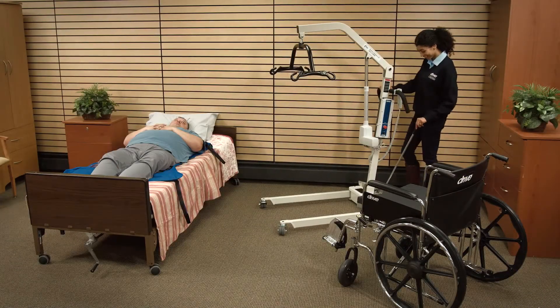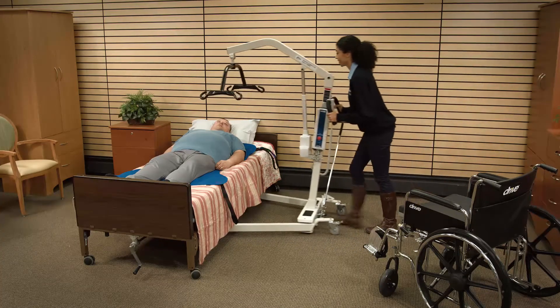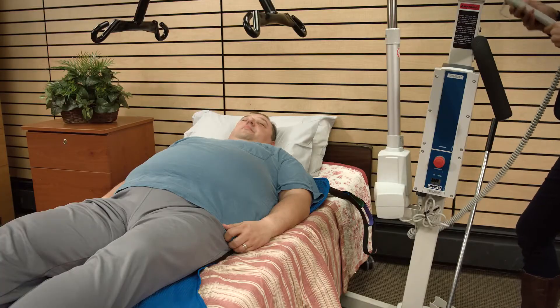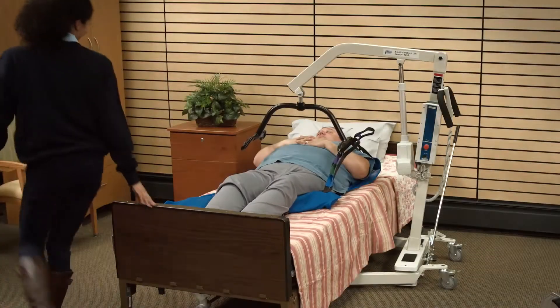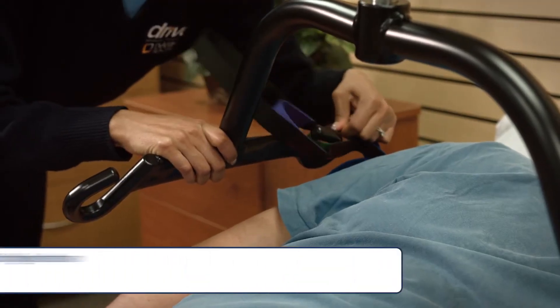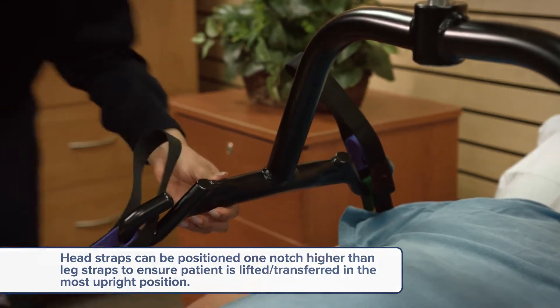Spread the base legs of the lift to the widest possible position. Make sure that the base of the lifter is under the bed. Press the down button on the control handset to lower the lift. You will need to use the hanging straps — hook those straps on the hanging bar. If a chain is used, make sure the S-hooks are away from the patient.